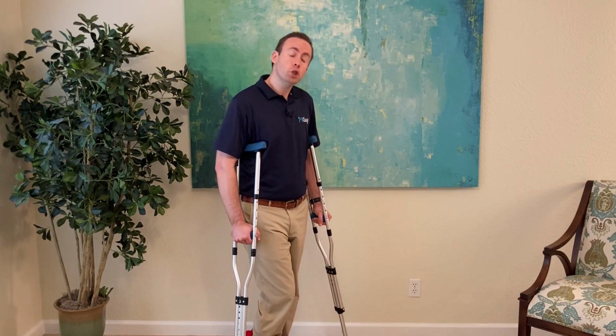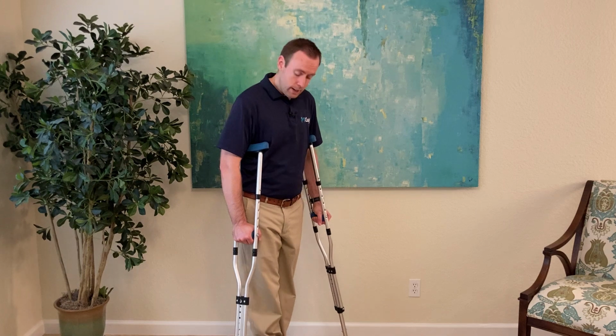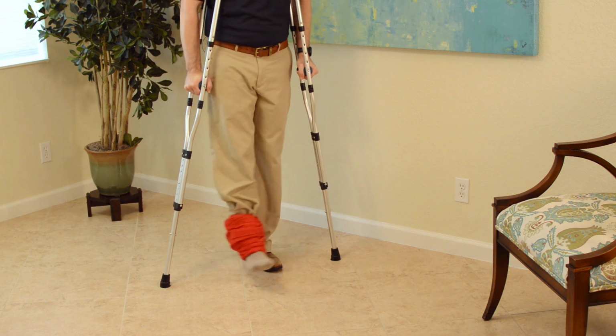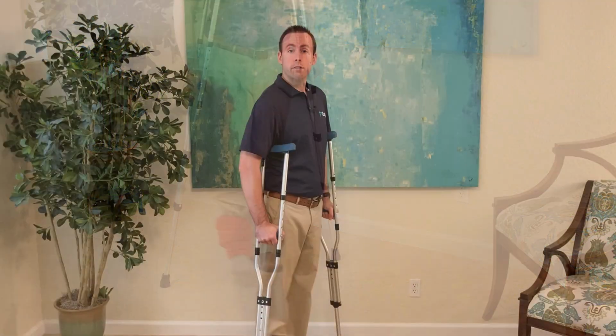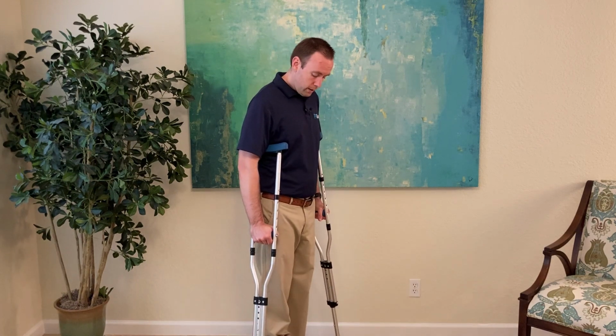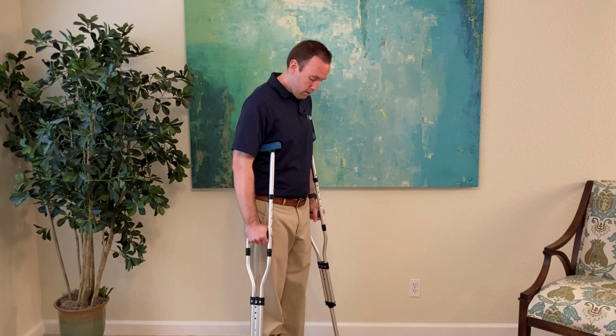So if you have a knee immobilizer or some kind of a brace that's keeping your knee straight, just wear a shoe on your left side and take your other shoe off on the right side. When you do that, look, I don't have to be concerned about tripping on that leg at all. So I just keep my toes up and I'm right there.